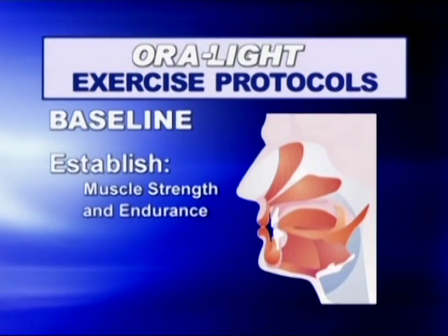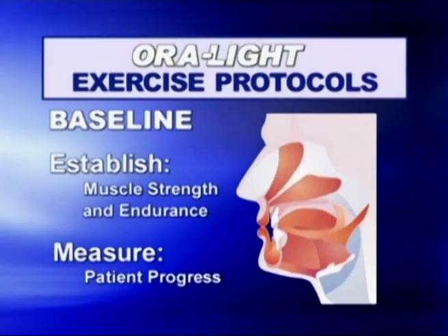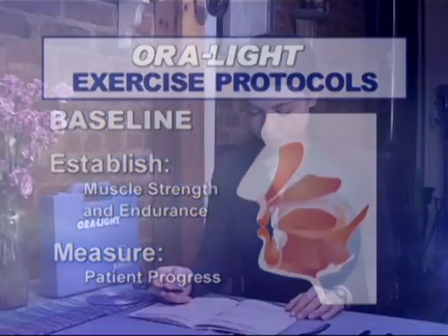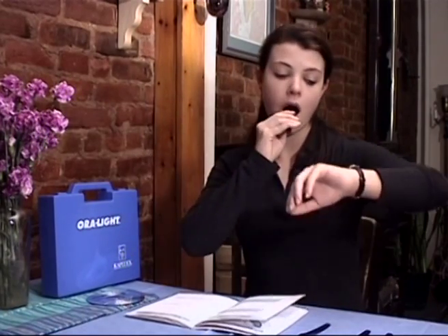start of training. The baseline exercise protocols also allow the therapist to measure progress during and at the conclusion of therapy. Patients who experience this therapy become highly motivated to succeed in rehabilitation as a result of positive feedback that is provided by improvement in functional competence.